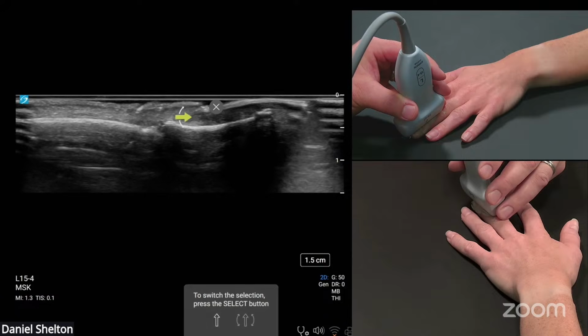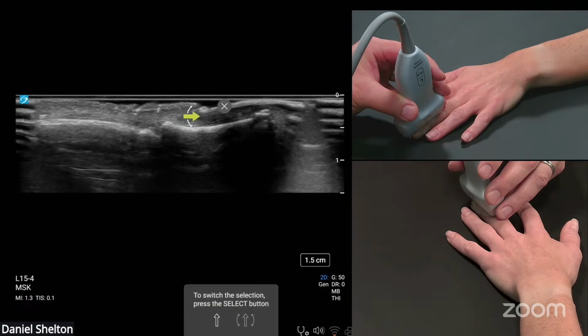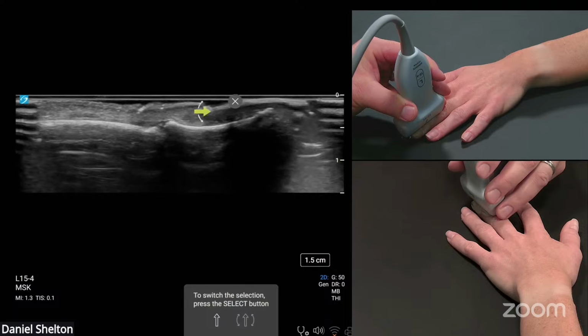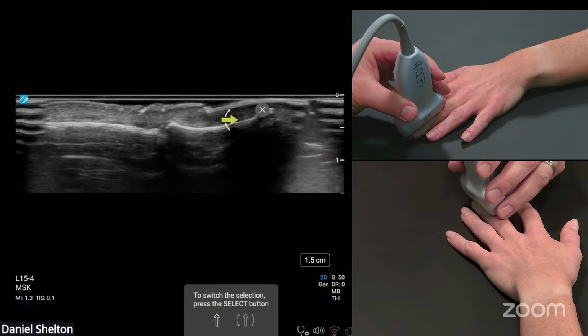So we're seeing what look like homogeneous fibers around the nail root. And what it is, is cross-sectional fibers going across the whole distal phalanx, wrapping around to the collaterals, basically acting like another pulley mechanism or hood, keeping the nail situated with this extensor tendon. And then we have the nail matrix down here, nail plate, nail bed.